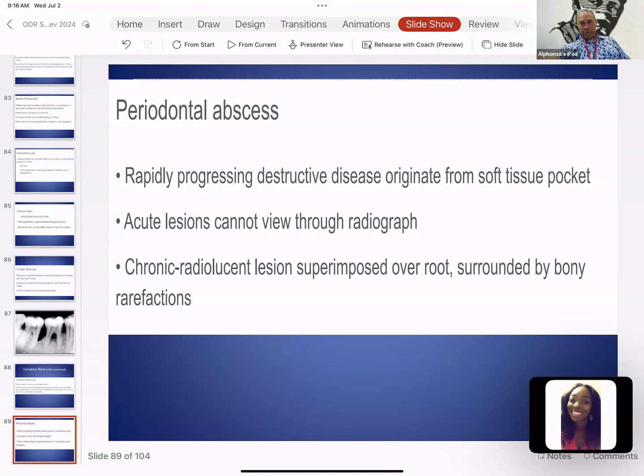And then, of course, if you're not sure where it's coming from, you can rub a little topical on the patient's abscessed area, and then take the end of your explorer and poke a little hole in it. Take a piece of the orange gutta percha point and poke it right through that opening and just keep pushing it and inserting it. You might have to go up and down a little bit to get it to follow the drainage, the little drainage area, back to the source.